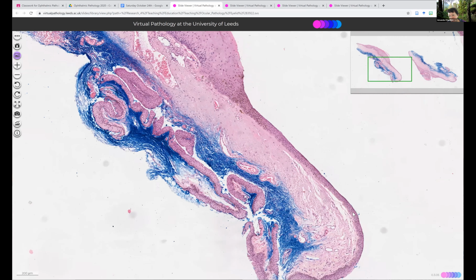So there's no skin adnexa, and of course in pterygia, if this is a bunch of solar elastosis, then we often get squamous metaplasia, don't we? Yes, that is true. So it can be quite hard to tell the difference between the two. I think if there's no skin adnexa and there's lots of solar elastosis, we need to presume it's probably a pterygium. And you see how dense this homogenization is underneath. That's all abnormal with damaged solar elastotic cells.